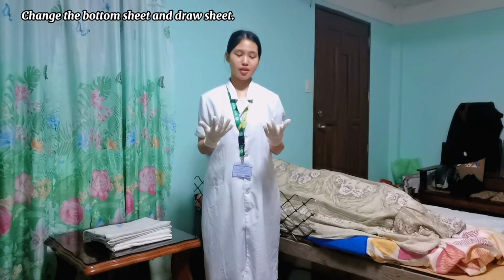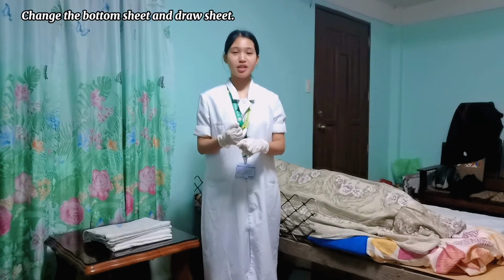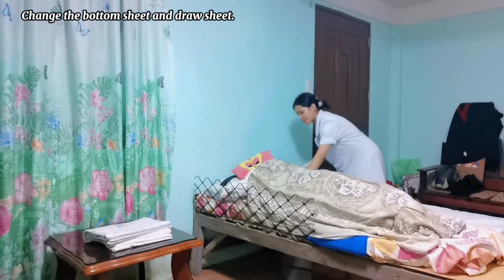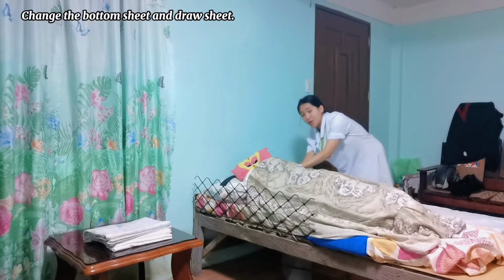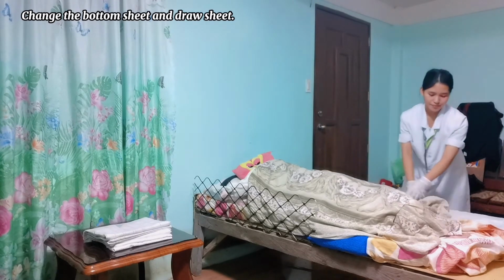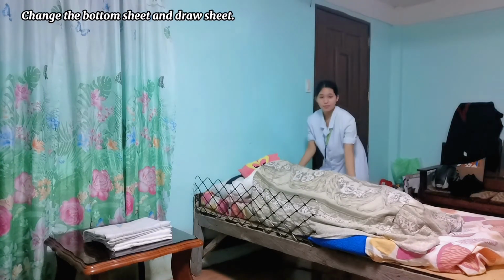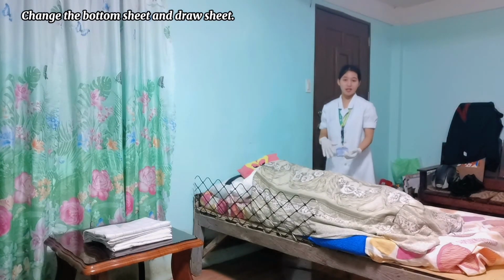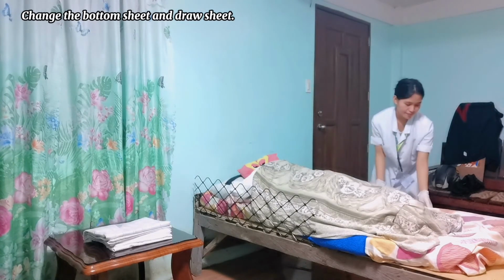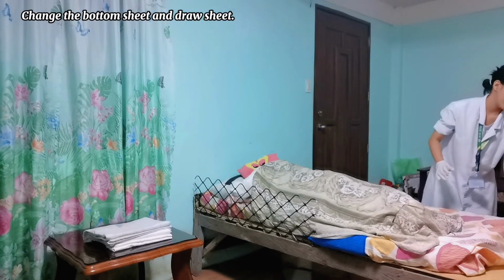After putting the gloves on, we will be moving to the other side to pull the bottom sheet, the draw sheet, and the rubber sheet. So now we are going to pull the bottom sheet into place. And then we are going to tuck it in under the mattress. And again, we're going to miter the edges of the bottom sheet.